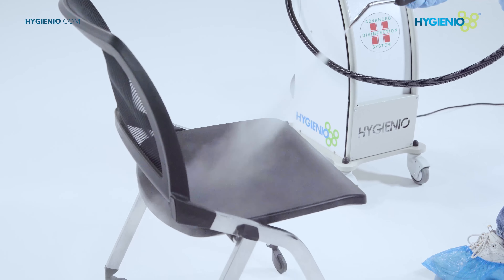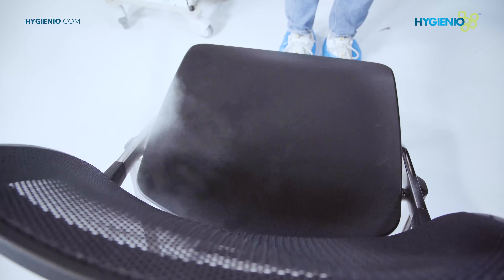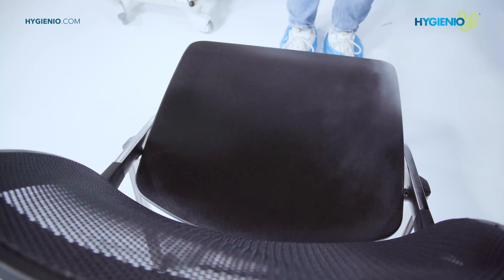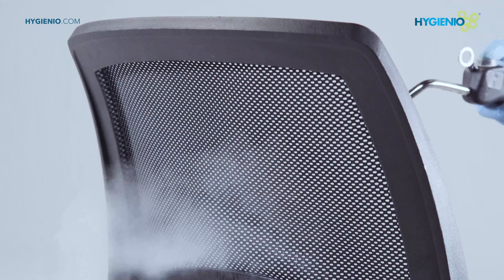How to apply the disinfectant? Keep a distance of about 40 to 60 centimeters from the surface or equipment to be treated. For areas with low or medium risk of contamination, proceed by applying the disinfectant in horizontal and vertical passes.